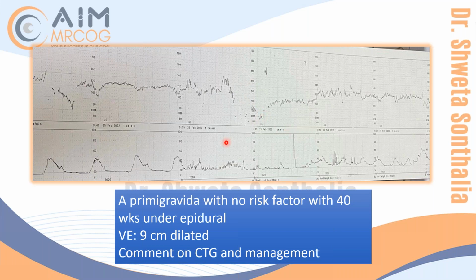Okay, so what are you going to do, what category do you keep the CTG then? In the last minutes it is normal. Yes, so what category is it? You have to tell the CTG for the last 30 minutes. Whenever you review a CTG, you have to review for the last 30 minutes. Sometimes for 20 minutes it is reassuring, 20 minutes it is normal, and then this is less.